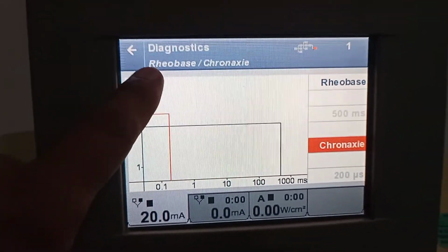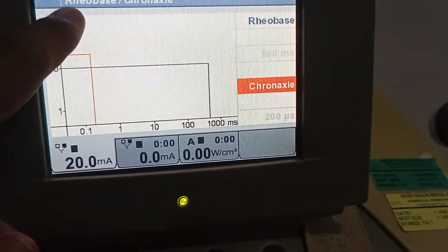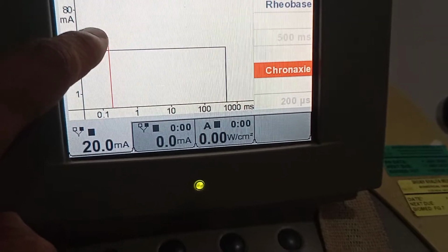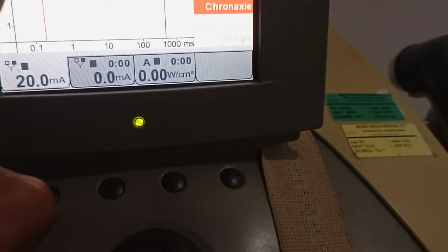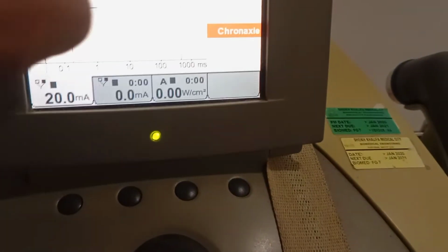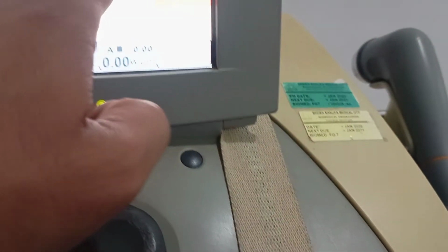What we need to do is join these points like this. We need to draw a line from the top to meet this point, and from this point to this point. So this is the normal curve. If the person is denervated or has a problem in the neuromuscular junction, this curve will be shifted towards the right, so it will be on the topmost aspect.